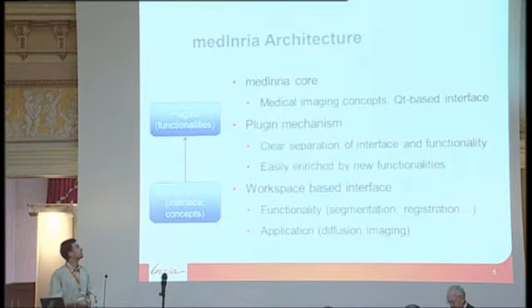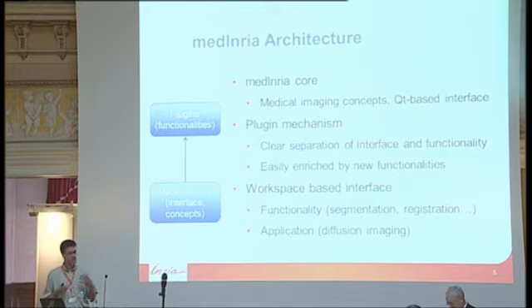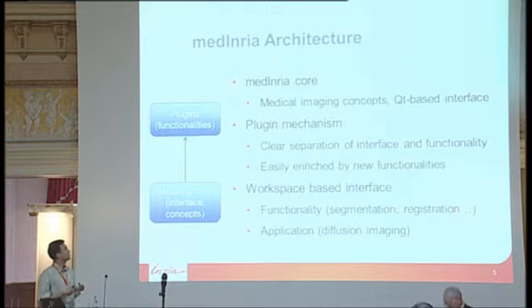So going a bit more into the technical details, MedInria is made principally of 2 main layers. The first layer is the core of the application, which contains the medical imaging related concepts like what is the data, what is the process, what it does. And then the second part of this first layer is the Qt-based interface. Well, the global shape, the global overall look of the interface.